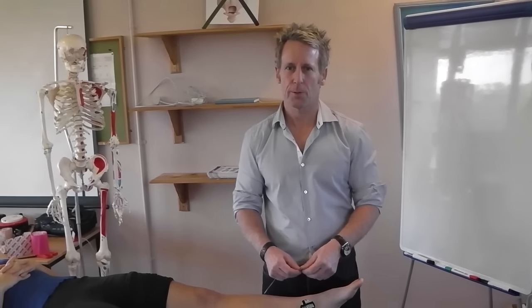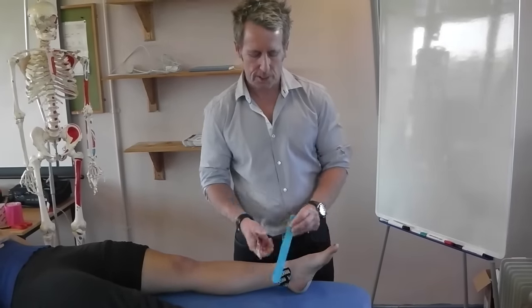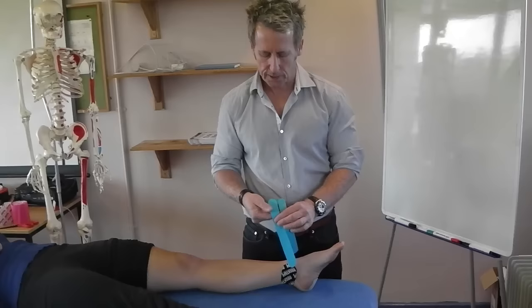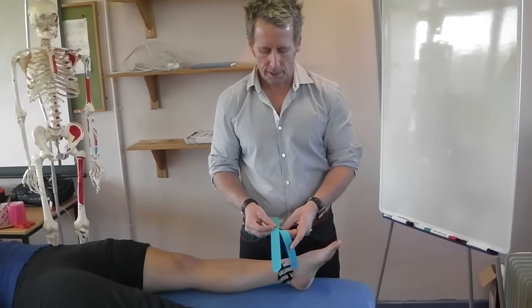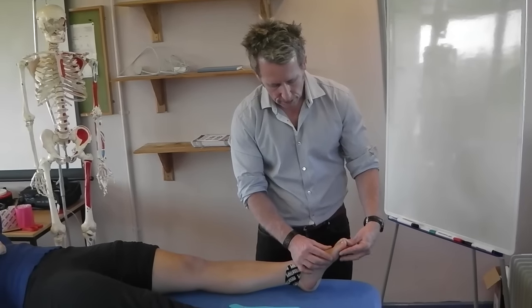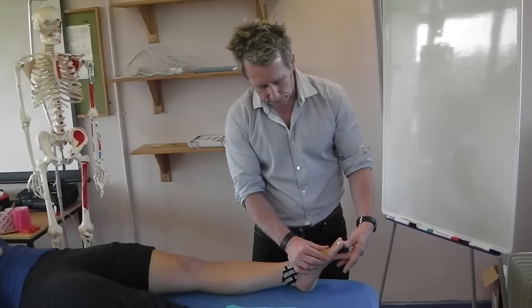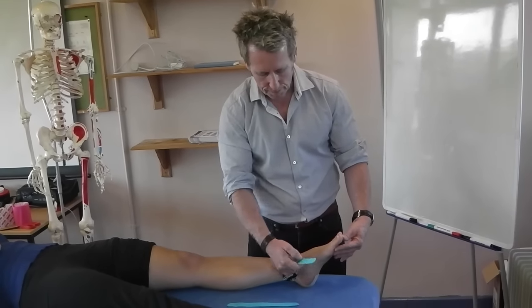Hi, my name is John Gibbons and today we're going to look at taping for hallux valgus using Rock Tape. I've got one five-centimetre size tape split into two and a half centimetres, or roughly one inch. What we're going to do is try to control the position of the valgus where you can have a bunion. I'm going to try to slightly have it in an abducted position and then use the tension of the tape to try to maintain its position.